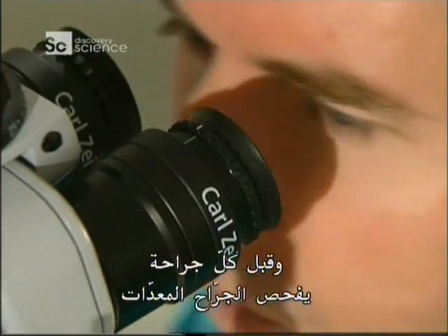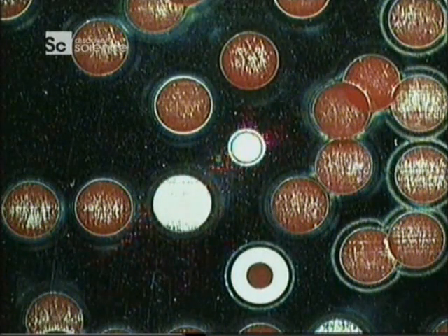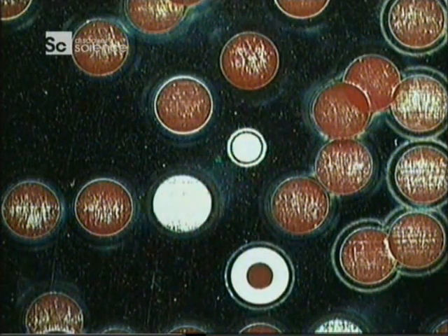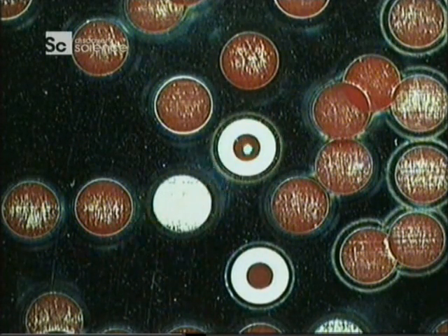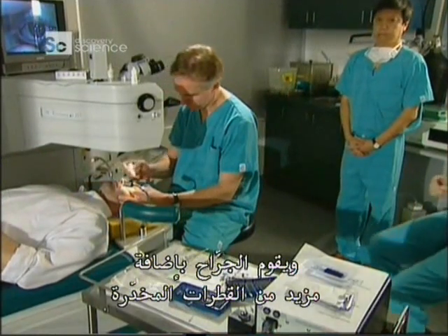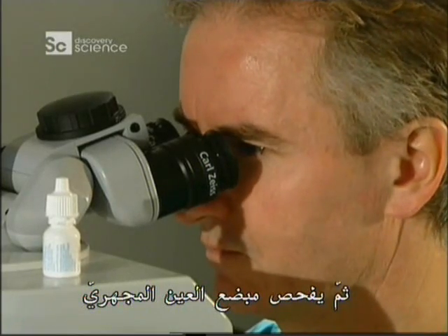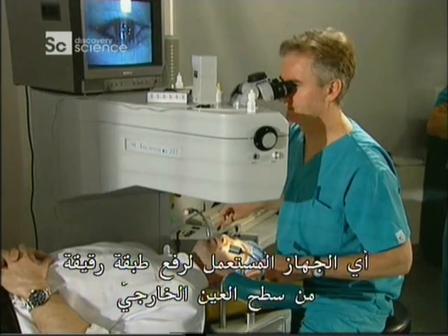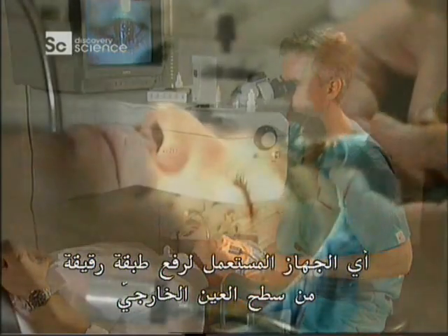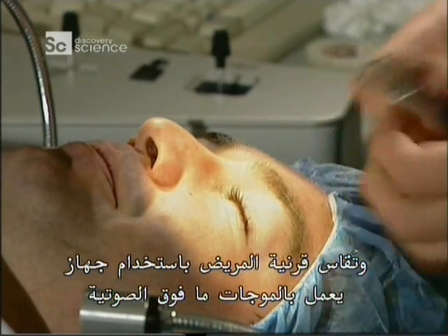Before every operation, the surgeon tests the equipment. He fires the laser on a metal plate to test its energy level. The surgeon then administers a few more anaesthetic drops and inspects the microkeratome — the device used to lift a very thin layer from the outer surface of the eye. The patient's cornea is measured using an ultrasonic instrument.